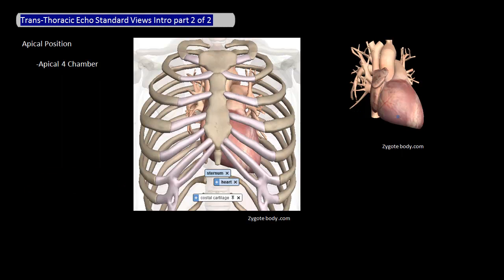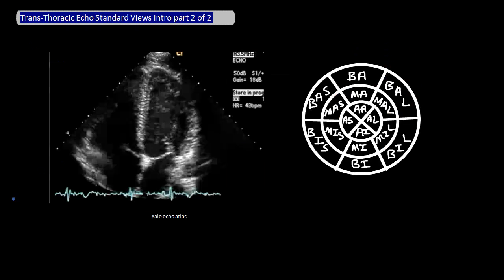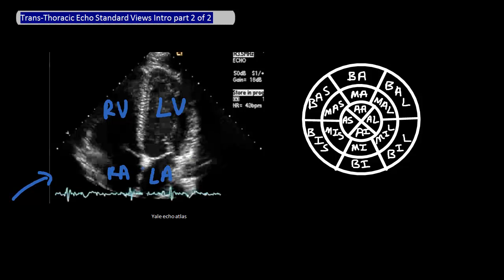The sixth view is the apical four-chamber view, which is at the apical position. The cut across the heart in this view is about here if you're looking at the heart from the front, and your goal is to see all four chambers of the heart. Here's an example of a real echo of this cut. Because you're at the apical position, the ventricles are going to be at the top — the left ventricle will be on the right side and the right ventricle will be on the left side. From there, it should be easy to identify the left atrium and the right atrium respectively.